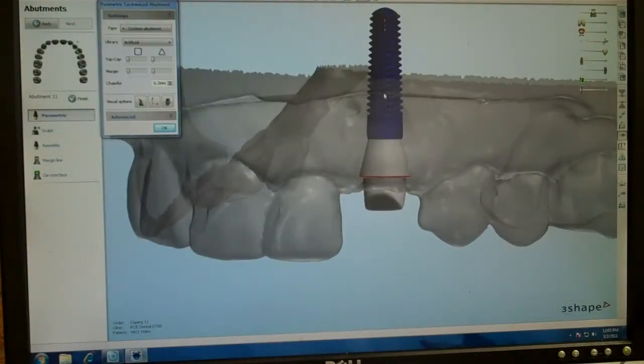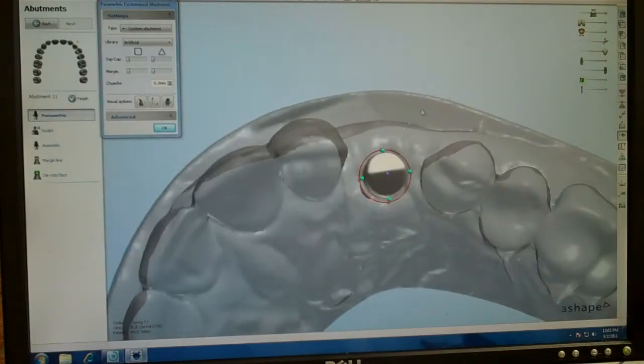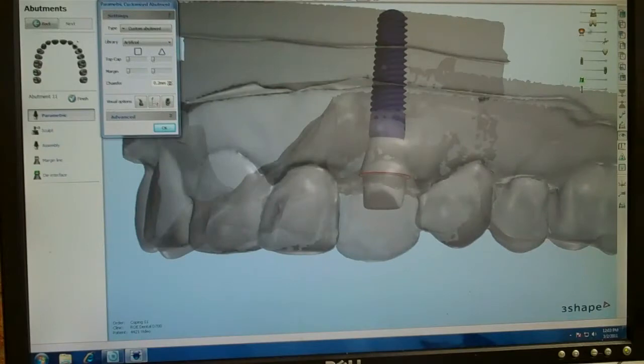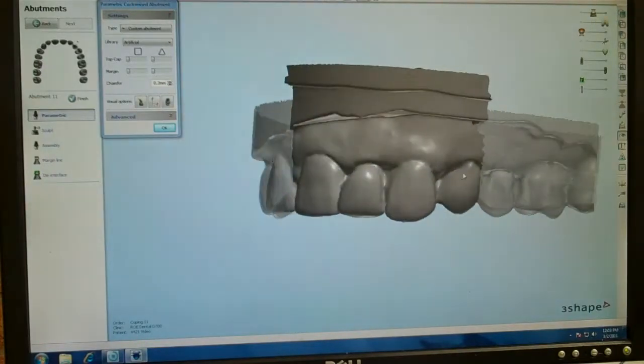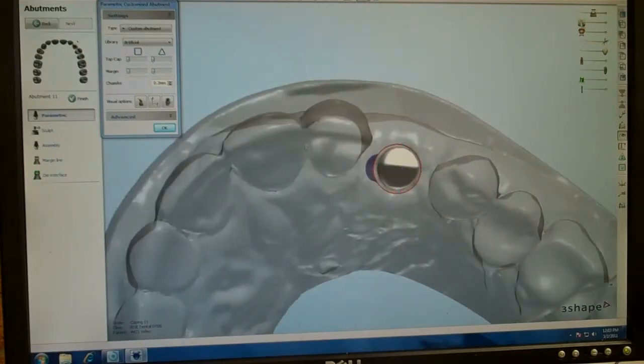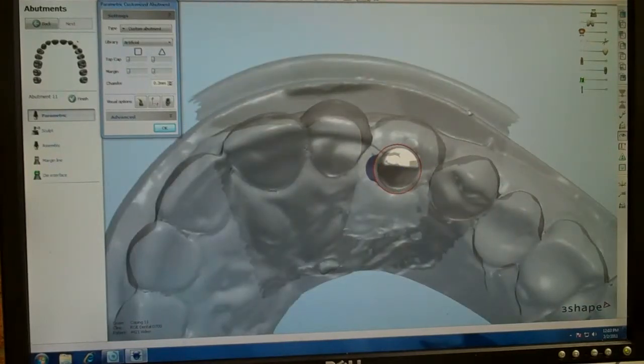Okay, this is the fixture. I'm going to bring in the wax-up — we do a wax-up on all the anterior cases so that when we design the abutment we can make it support the contours of what the final restoration is going to look like. That's our wax-up superimposed over the model.